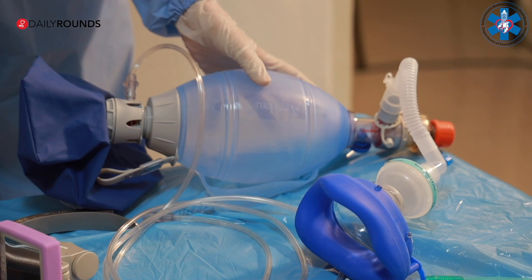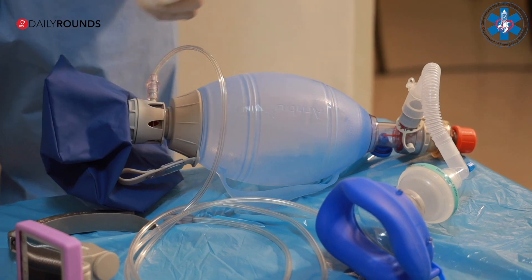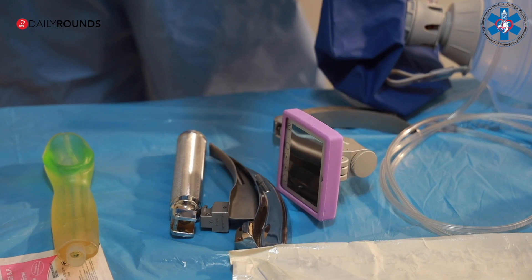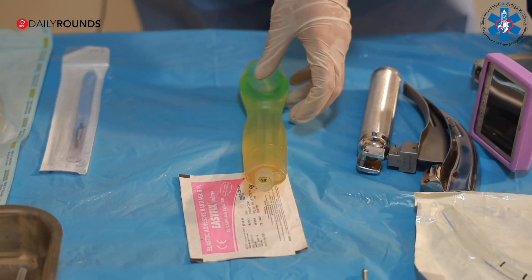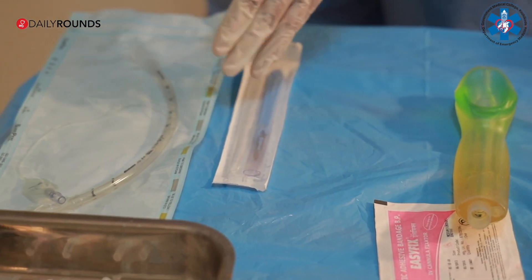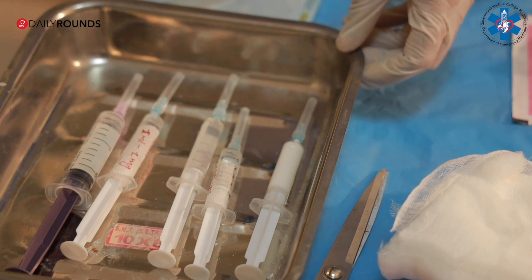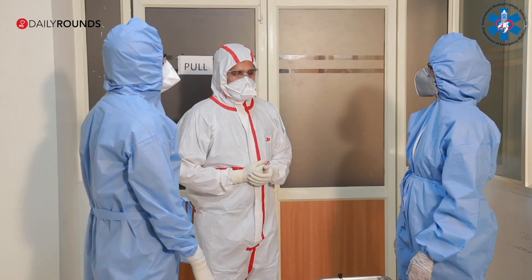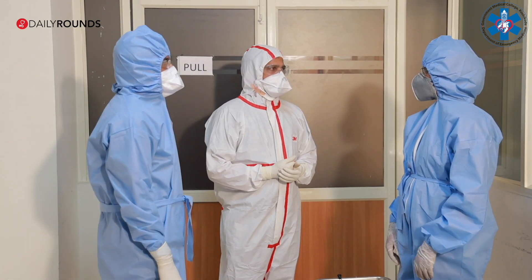The team has a modified bag-mask device with viral filters, catheter mount, and PEEP valve attached. The primary plan is video laryngoscopy-assisted intubation. If that fails, a second-generation supraglottic airway device — an i-gel — will be used. For a can't intubate, can't ventilate situation, front of neck access is the backup. All necessary drugs are drawn and loaded into syringes. The team confirms readiness.